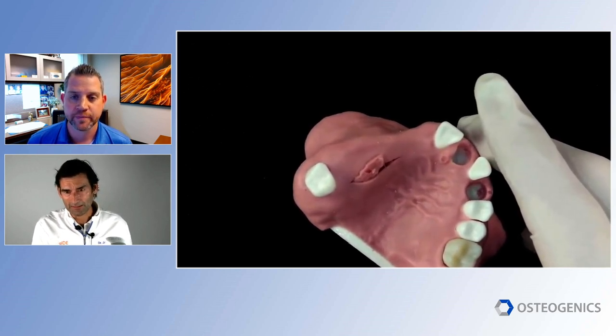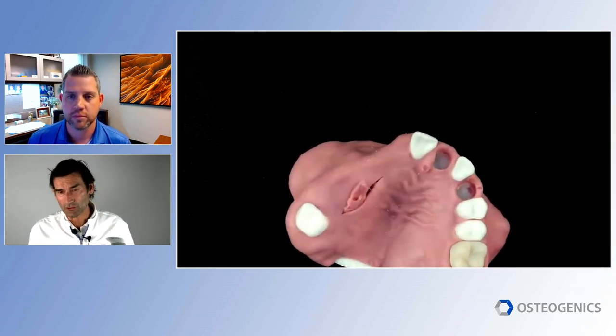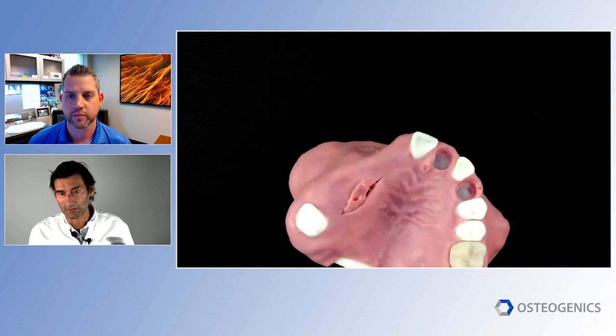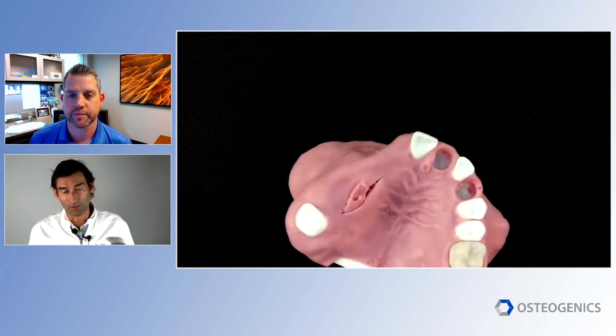Yeah, and I really don't think patients are having any issues with this. But if you want to go shorter, I would just ask the patient to come back, or maybe you have a different product that you can find. The one thing I would discourage you from is using gut. You can use it in cases like a third molar, where you're doing a quick procedure, but when you're doing fine procedures, like mucogingival grafting and implant procedures, I don't think gut has any place in it.